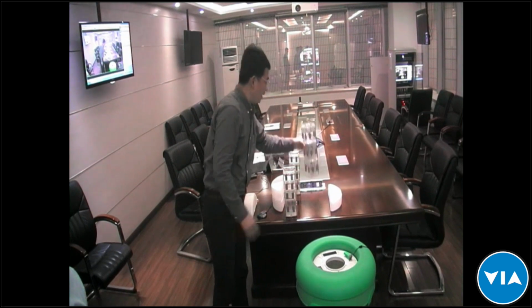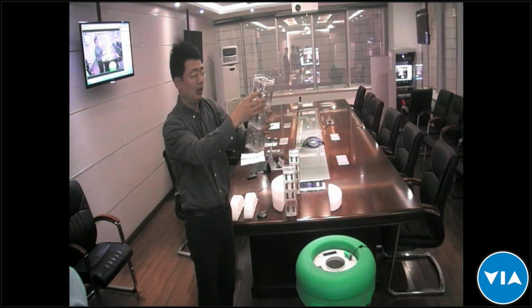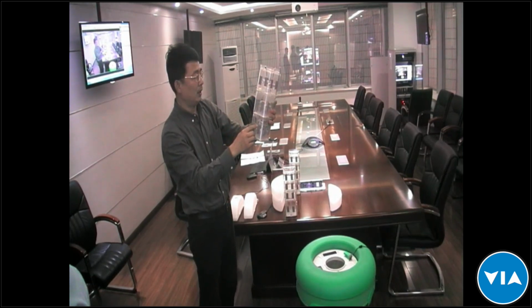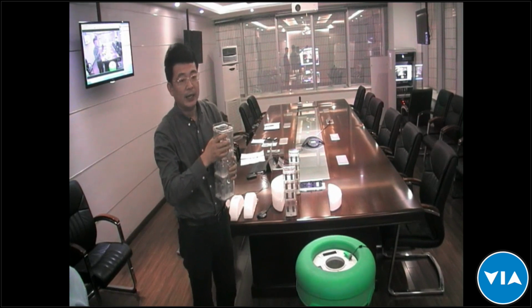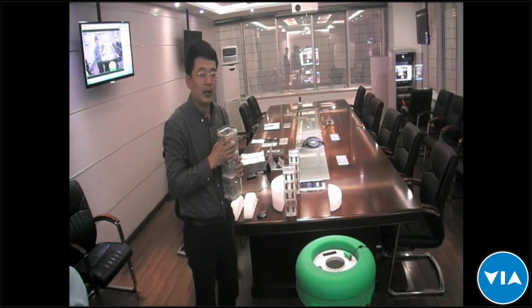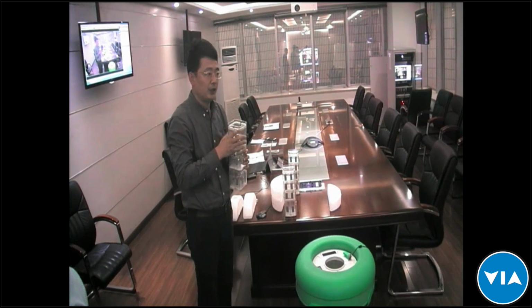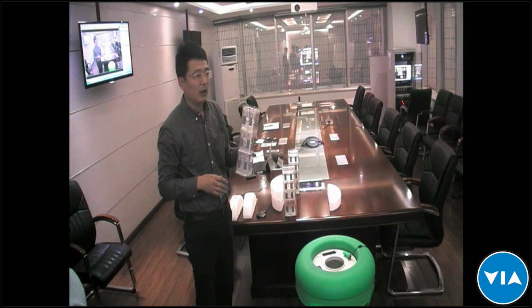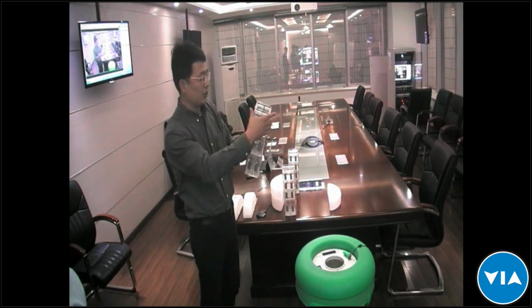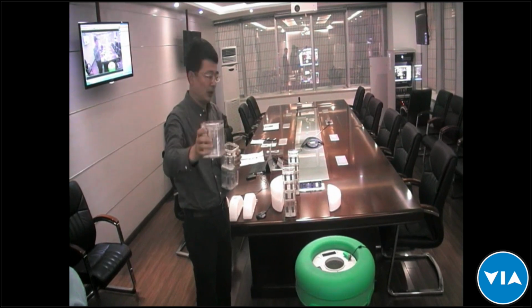And there's a daily-use cover on the top of the larger one. That is used for daily purposes, when the nurse or the users need to take the vaccines for a day's volume of need. They can just take them apart from the top. This one.